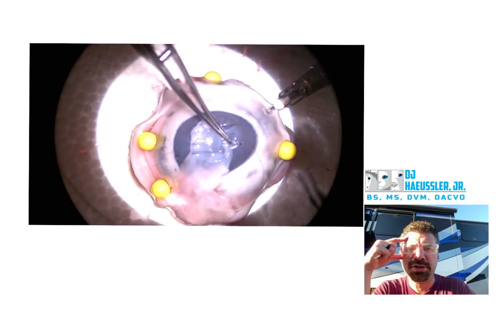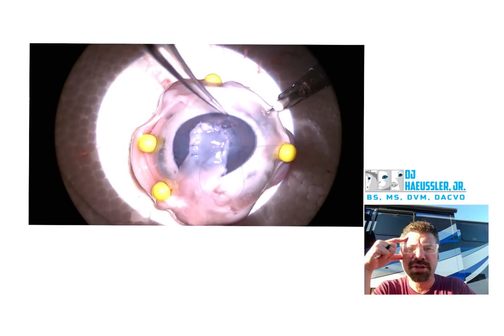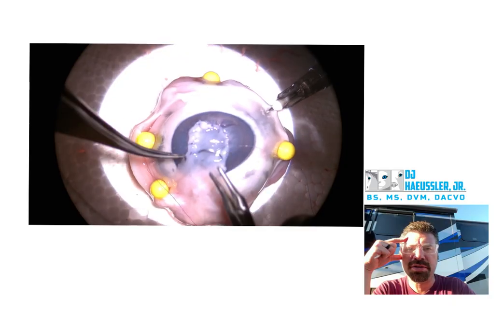That's a good hold right here when you drive that through — that's great. Manipulation of the suture as you get it over there, that's great as well.